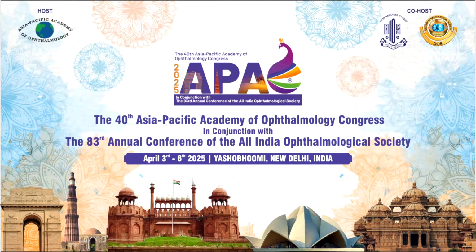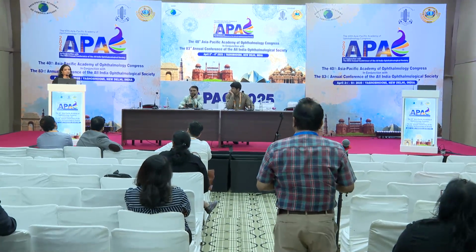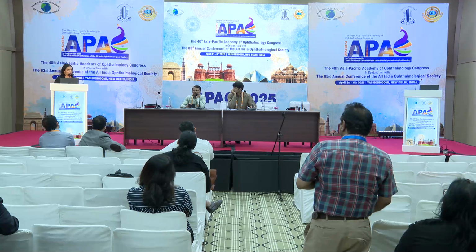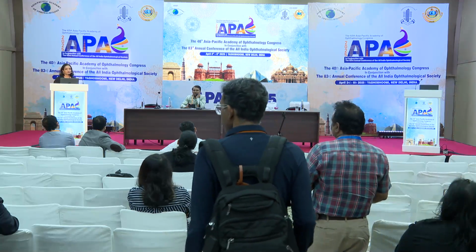Any questions from the audience? Yeah. So now, is there any role of FFA in diabetic macular edema? Definitely. If there is a recalcitrant DME and there are parafoveal cystic changes, and compared to OCTA, if we have the option of OCTA, so you have OCTA and FFA, then both of them have very specific indications.